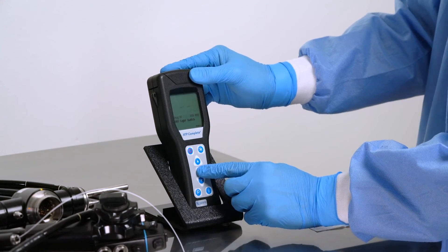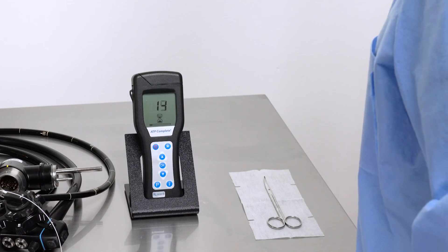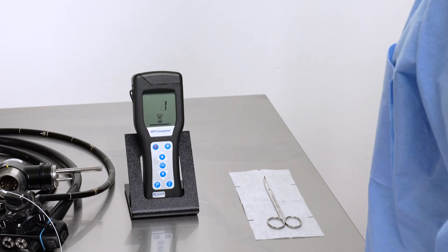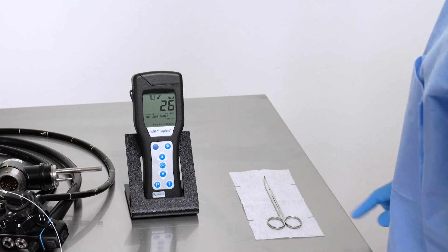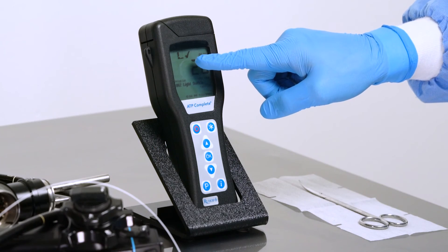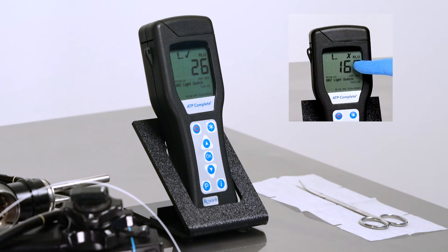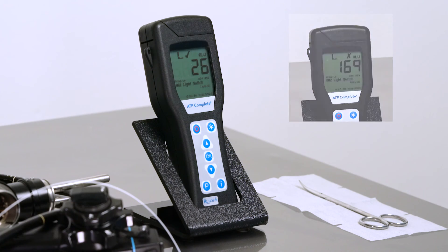In 15 seconds, the ATP Complete device will display the amount of contamination detected. A check mark indicates that the test has passed while an X appears if the test has failed. A failed test signals that the scope must be recleaned and tested again.